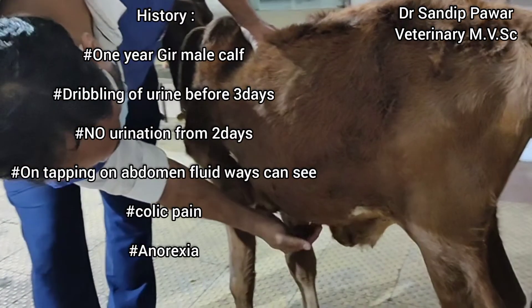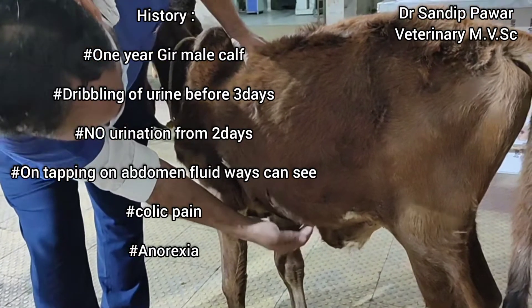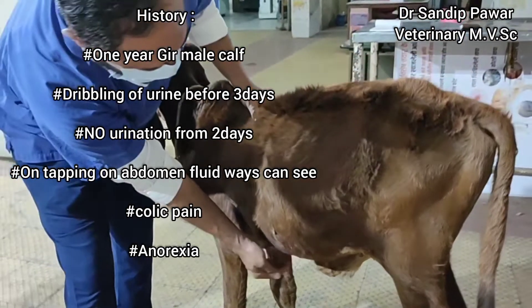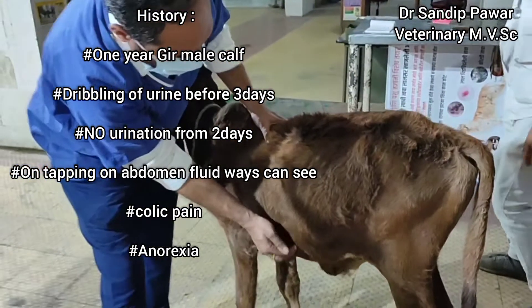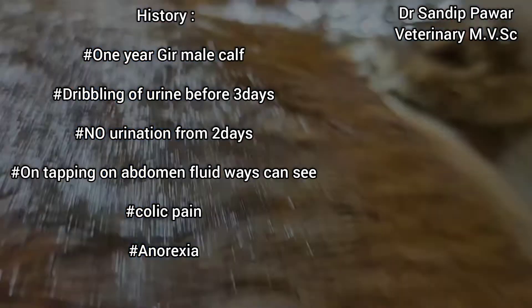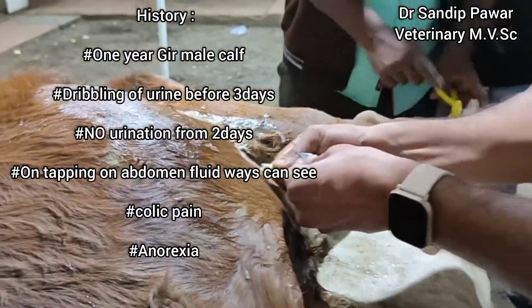Hello everyone. In today's video we will learn about tube cystotomy. Tube cystotomy is the surgical correction to treat the obstruction of the urine flow due to kidney stones or urolithiasis.